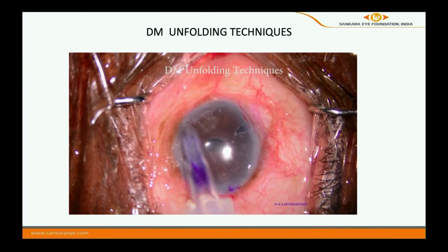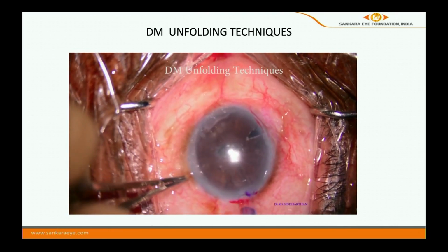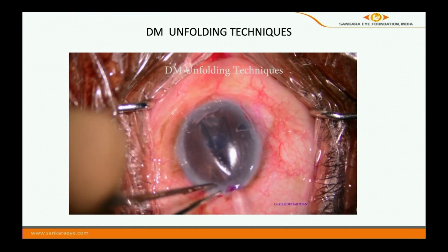So coming to the unfolding techniques, these are some unfolding techniques which have evolved, and finally I'll be showing what I have been doing, some edited videos and 6-7 unedited videos. You will be able to see what happens.